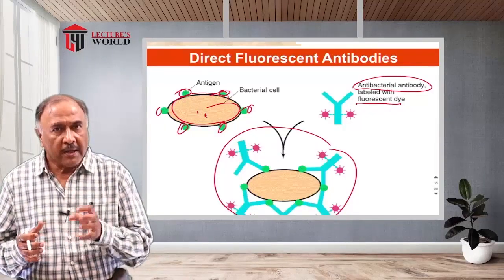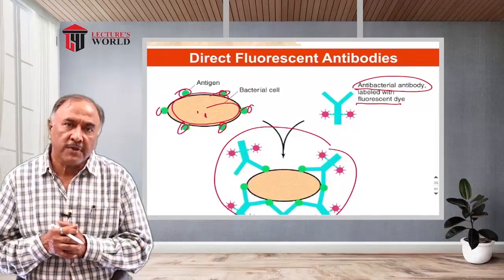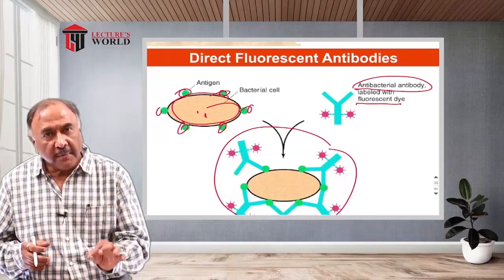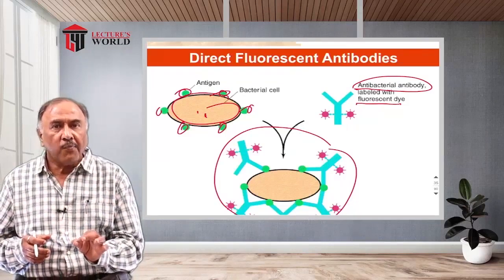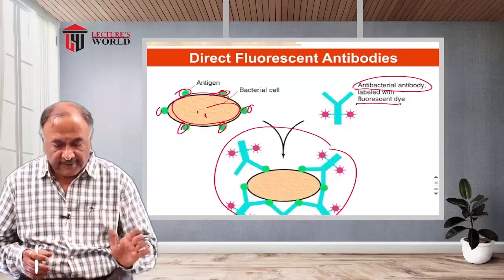So, an antibody against a specific organism is being used here. What makes them fluorescent is that the antibodies are tagged, they are tied with some fluorescent dyes.